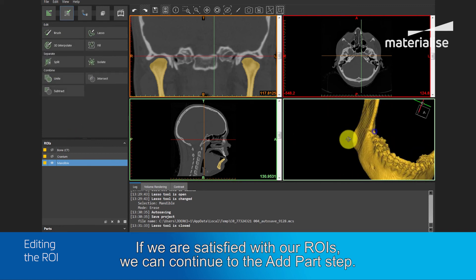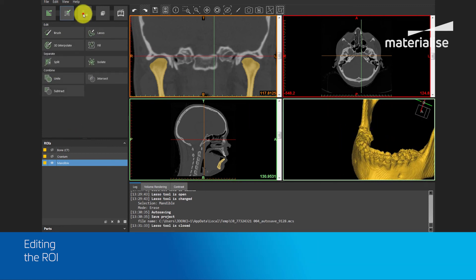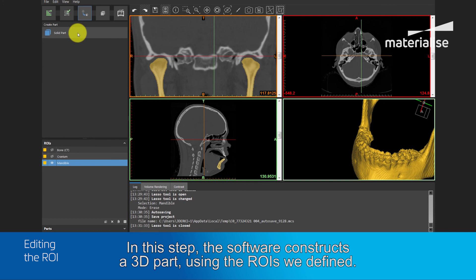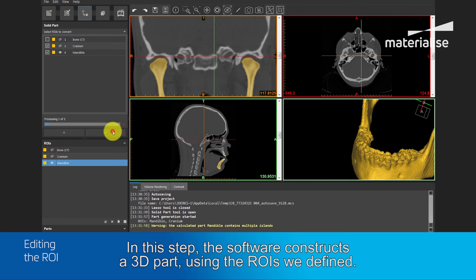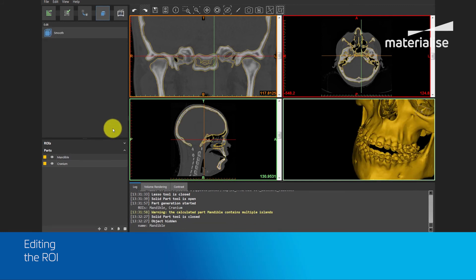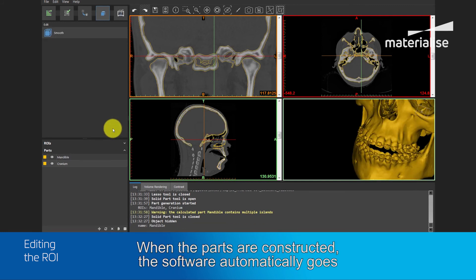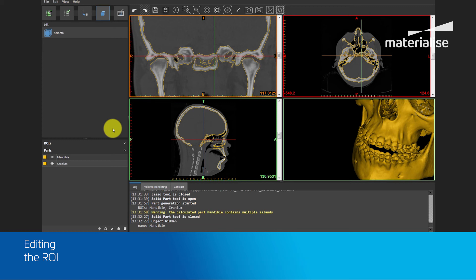If we are satisfied with our region of interest, we can continue to the add parts step. In this step, the software constructs a 3D part using the region of interest we define. When the parts are constructed, the software automatically goes to the fourth step, called edit part.